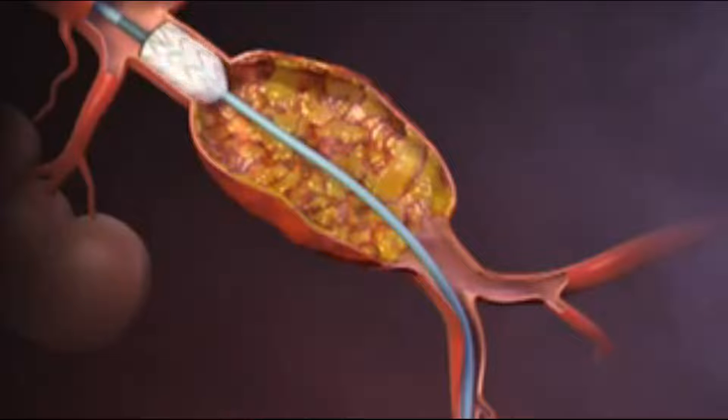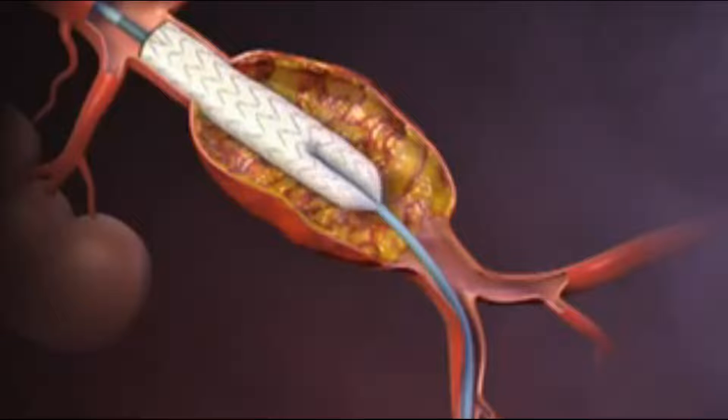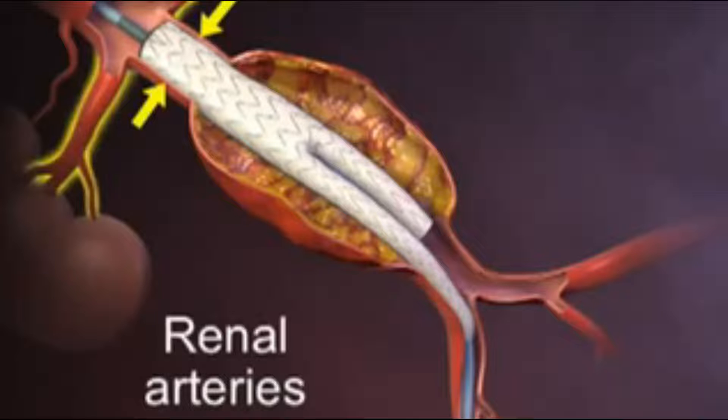The body of the stent graft, composed of a non-permeable polyester material supported by a self-expanding flexible metal frame, is partially deployed, with the undeployed upper portion of the device positioned immediately below the renal arteries.